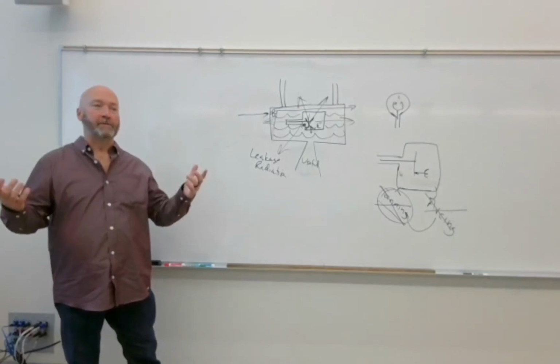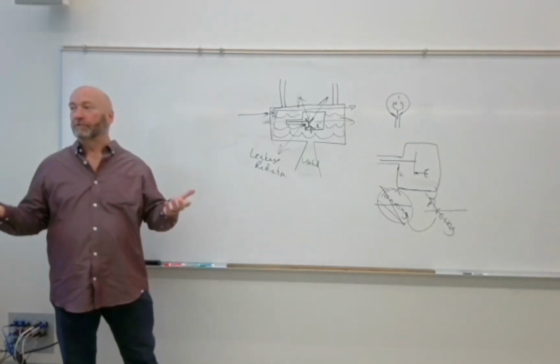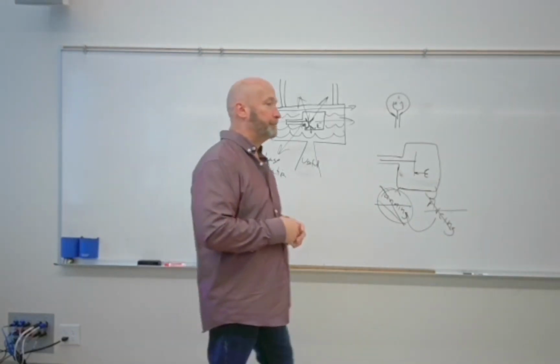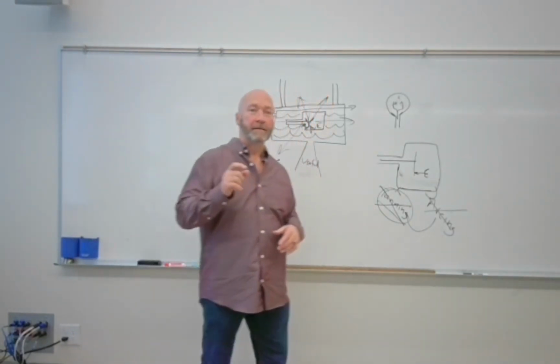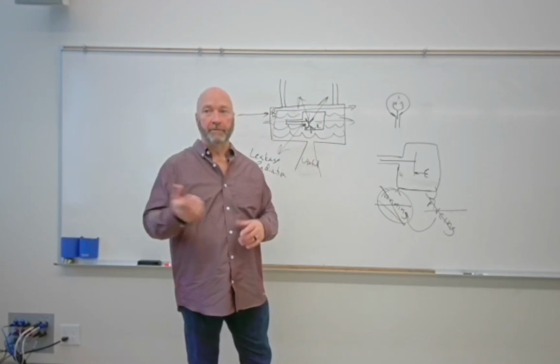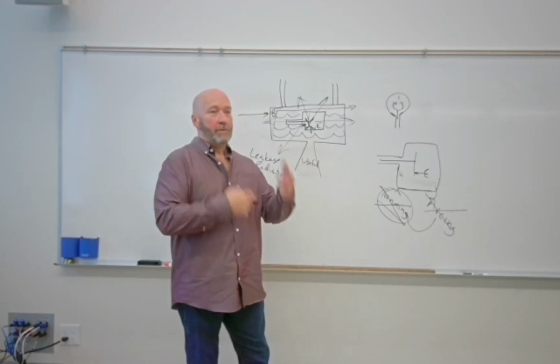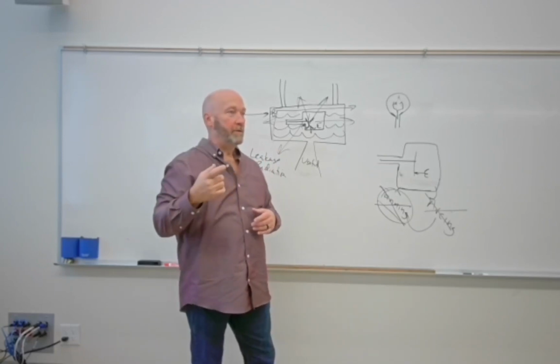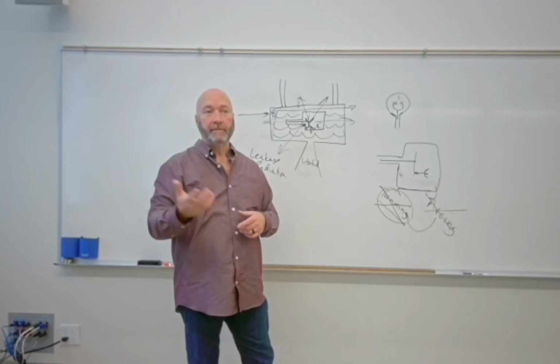So if you're making high exposures, we want to use that large filament. As a matter of fact, if you try to select the small filament with a high mA station, it's going to give you a tube overload. So where I was going with all this, with the burnout X-ray tube, is that you can kind of diagnose X-ray tubes sometimes.